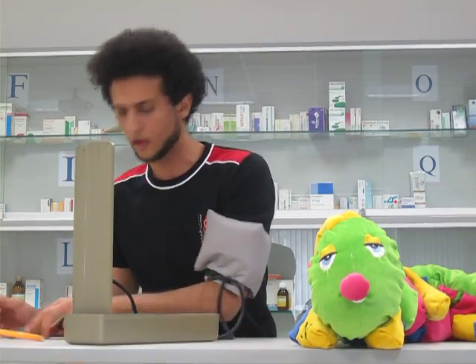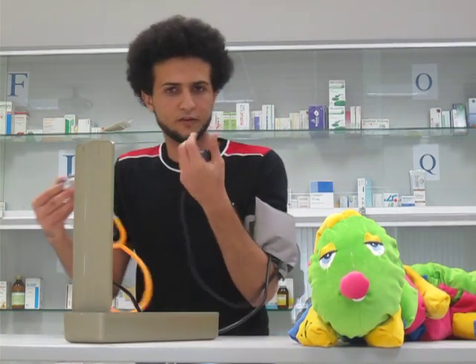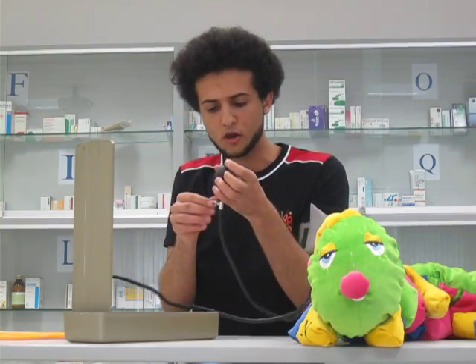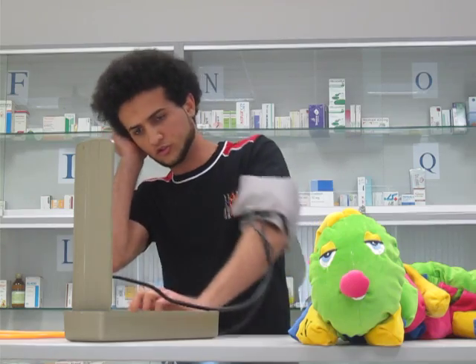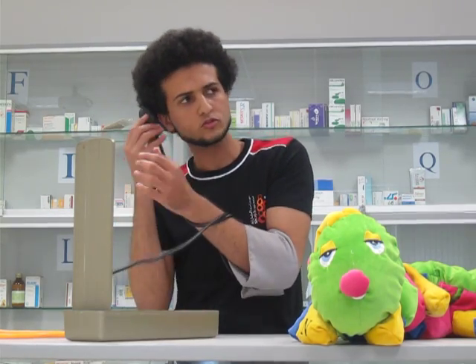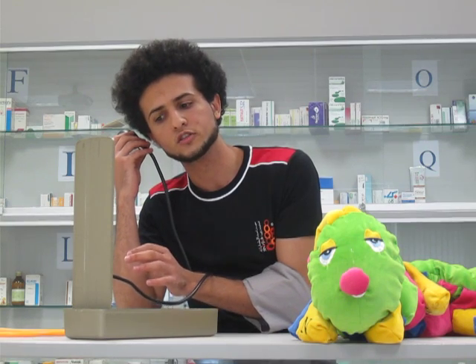Then, you use the stethoscope to listen, but I'm very professional so I will just open this way and try to listen for it. This is systolic. This is diastolic.